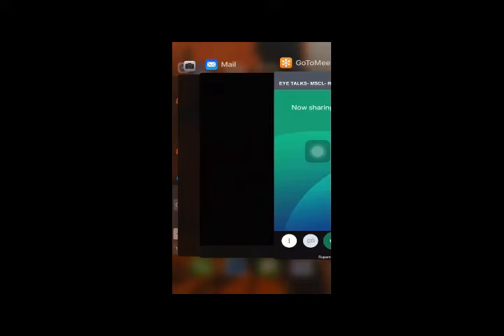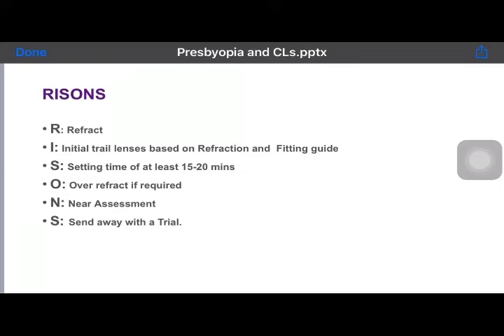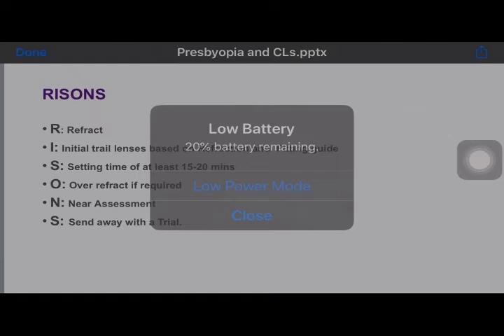Yes, sir. Do aspheric multifocal contact lenses utilize accommodation and pupillary constriction? In the case of center near lenses, the patient might have a distance vision problem. So with the near lenses there is brighter illumination. So what is the solution for it? So it's the pupil reacting to the light. Okay.